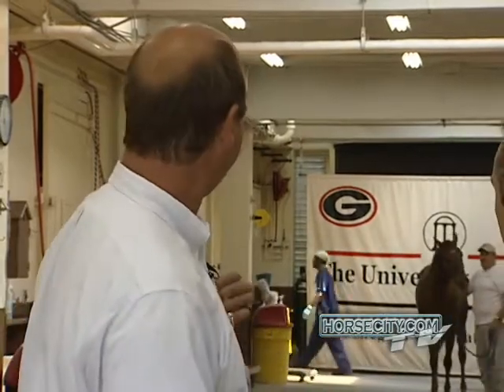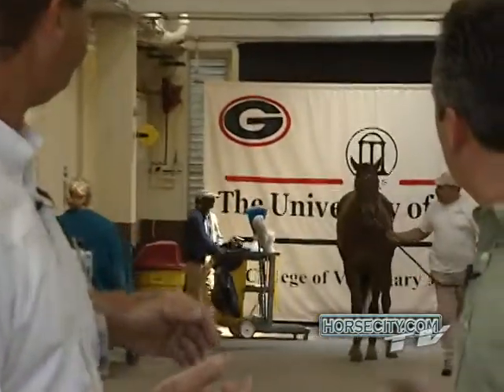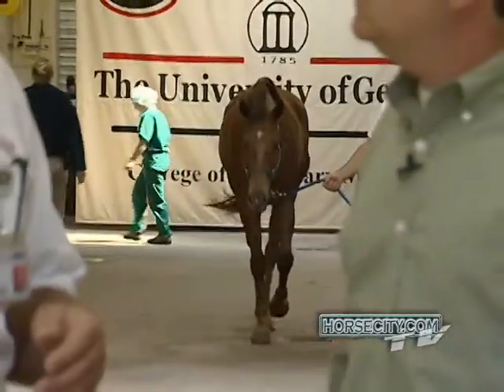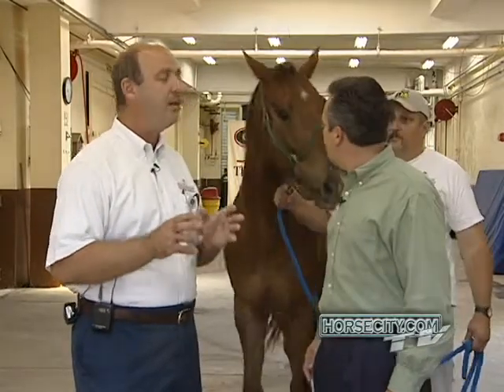When we look back here at our patient, he's going to be sent in today for a performance problem. And one of the things we commonly do after we get these horses and we go through a lameness test with them is we're going to take them to radiology. Radiology is such an important thing because we're trying to isolate very small problems in an animal's joint and see if we can come up with a diagnosis here.